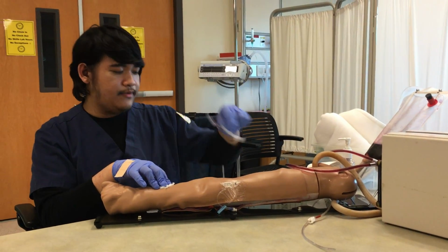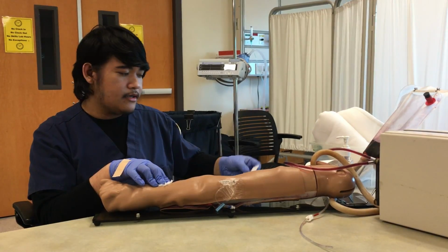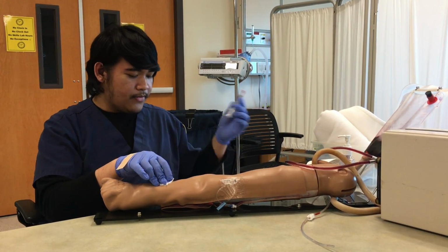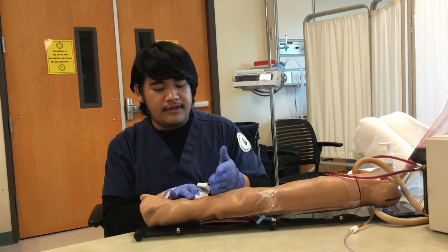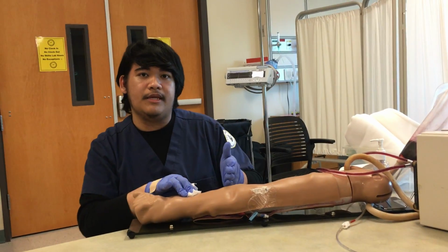So once I'm done doing this, I could put the requisition slip in here and put it in the biohazard bag. And then while we're doing this, we apply pressure because we want to stop the bleeding.